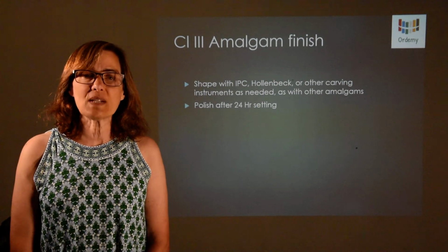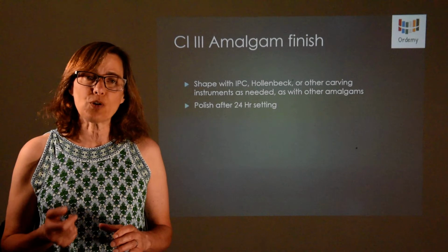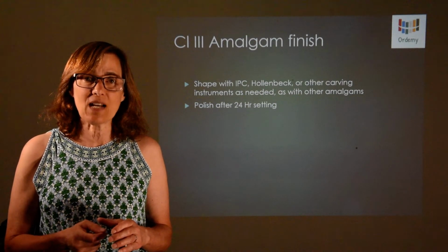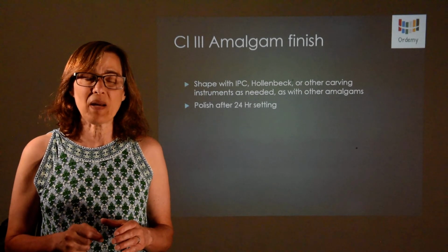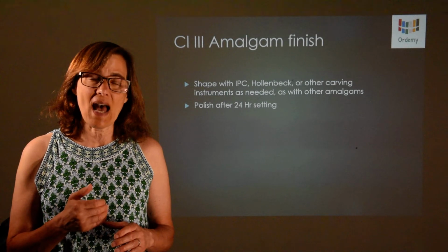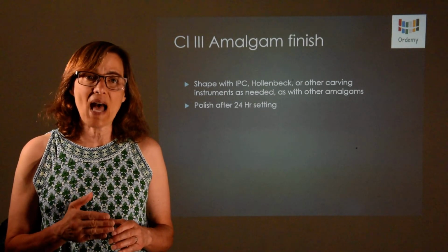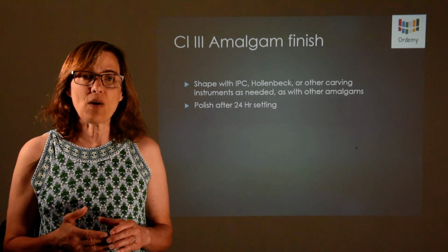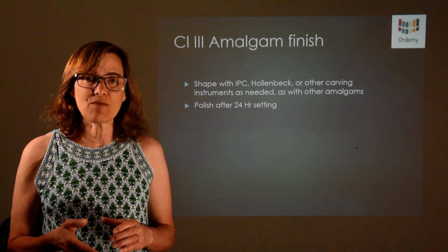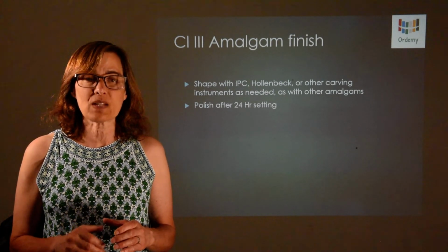With the 1-2 condenser, at a 45-degree angle, you will place it in the retention areas that the dentist has prepared. They're usually on the lingual axial line angle and buccal axial line angle, as well as some dentists also put a retentive groove at the actual floor of those line angles.